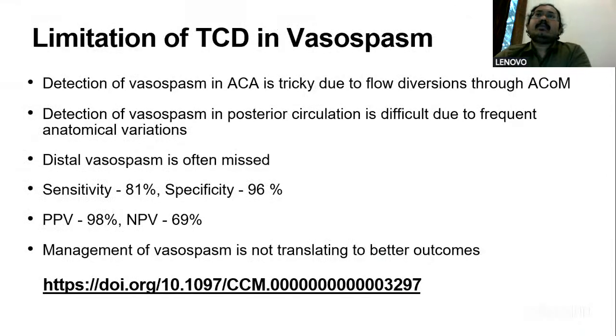Many people embrace transcranial Doppler in the management of vasospasm, but there is also literature which goes against the utility of transcranial Doppler in vasospasm.